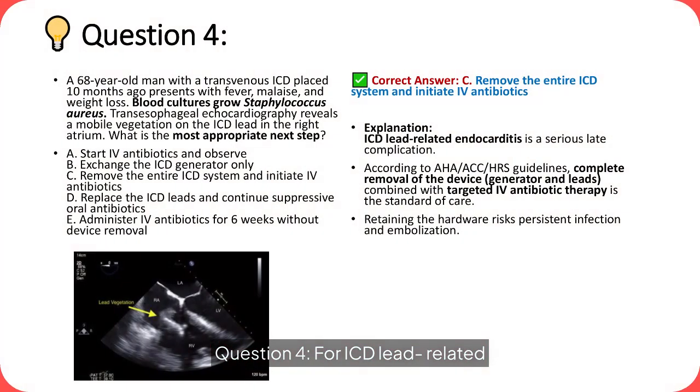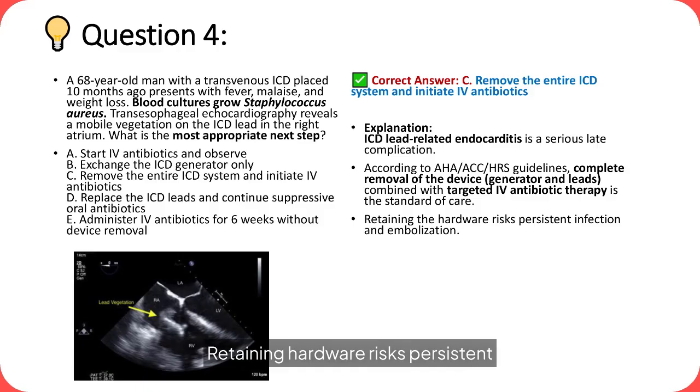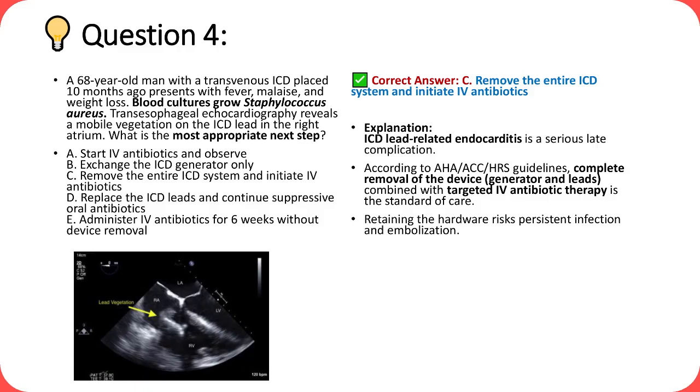Question 4. This case illustrates a classic presentation of ICD lead-related endocarditis, a serious and potentially life-threatening complication that typically occurs months after device implantation. The patient presents with systemic symptoms including fever and weight loss, and blood cultures positive for Staphylococcus aureus, along with transesophageal echocardiography confirming a vegetation on the ICD lead.